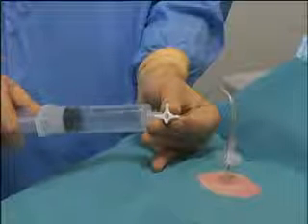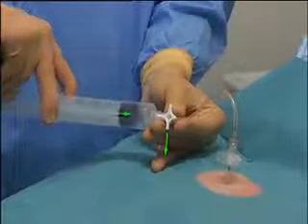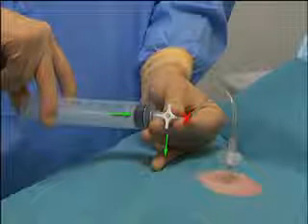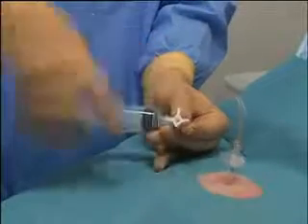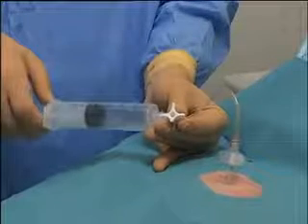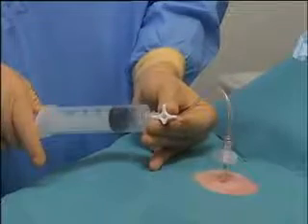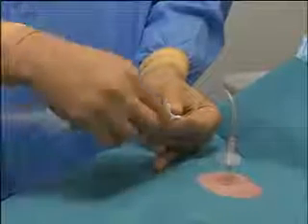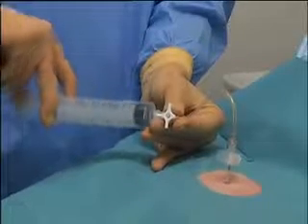To evacuate the air into the ambient air, you must turn the stopcock so that the syringe is connected with the environment, but not with the patient. Make sure that the pleural space is never connected with the environment while you are turning the stopcock. Measure the volume of the air that is aspirated by counting the number of syringes evacuated. If more than 2.5 liters have been evacuated, the procedure should probably be stopped because such a large volume suggests that there is an air leak.